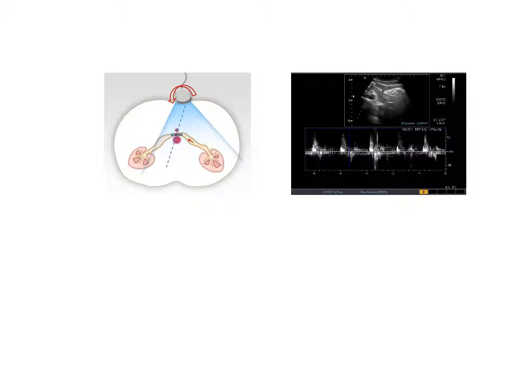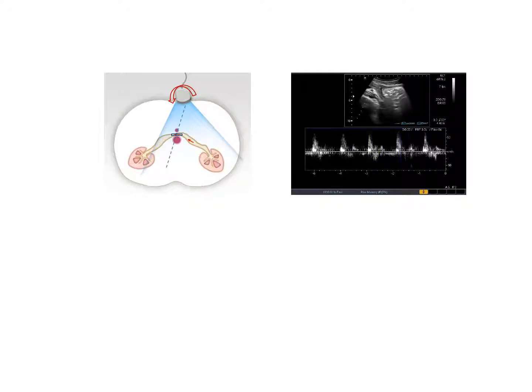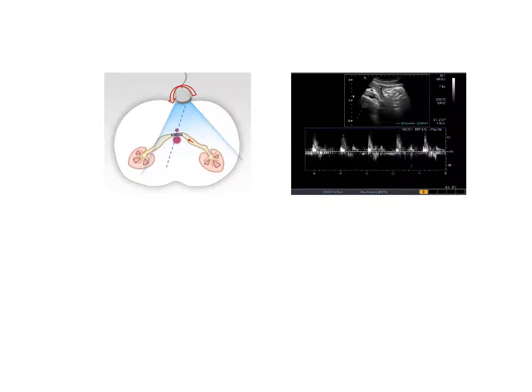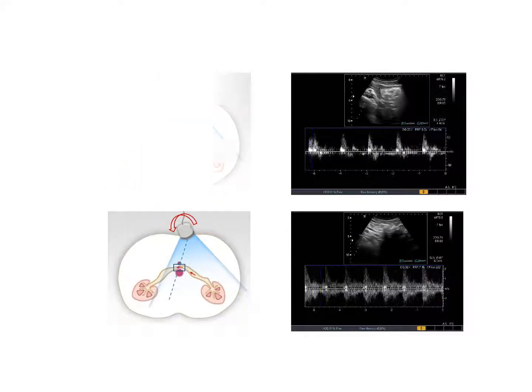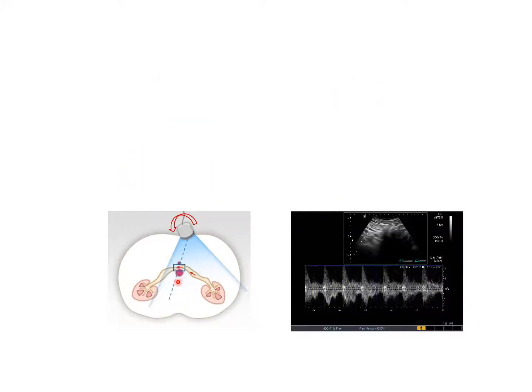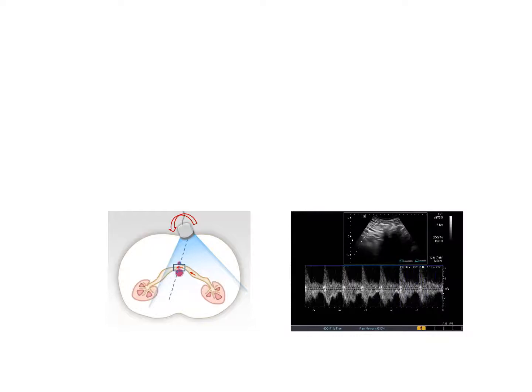But still, it is difficult to get clear spectra because the left renal vein between the pulsating aorta and the superior mesenteric artery is moving in and outside of the sample volume. If we make the sample volume bigger, now we can get clear spectra because the left renal vein between the pulsating arteries stays within the wide sample volume.